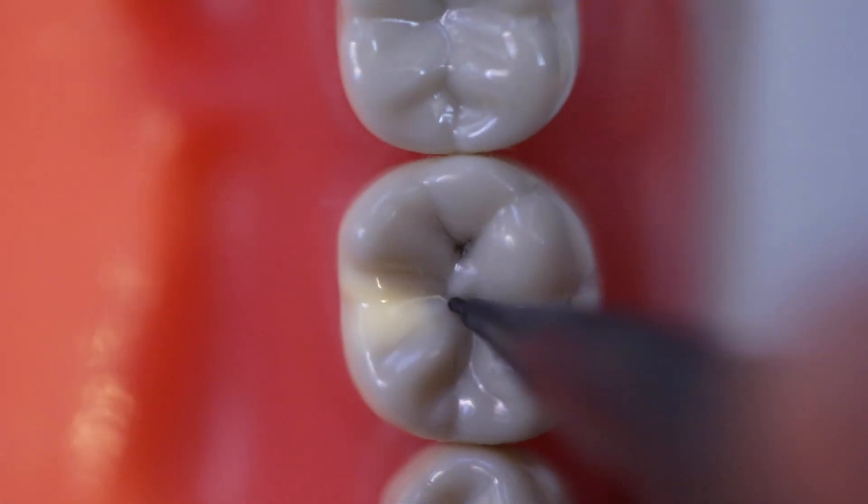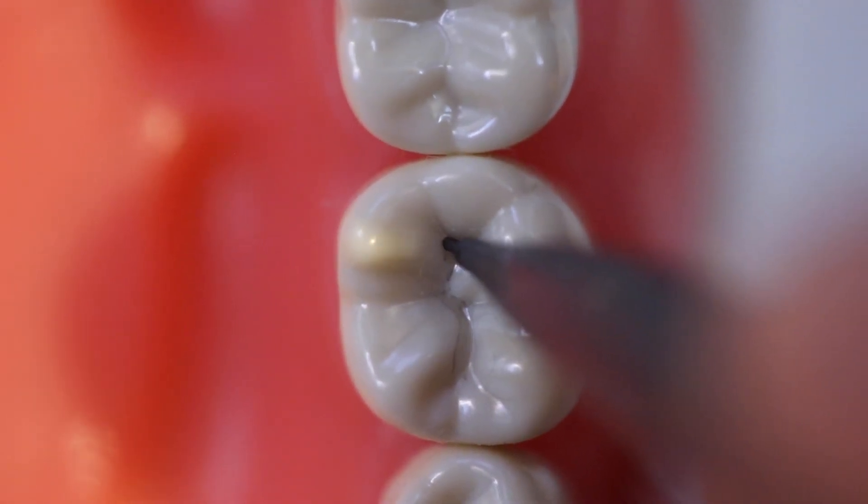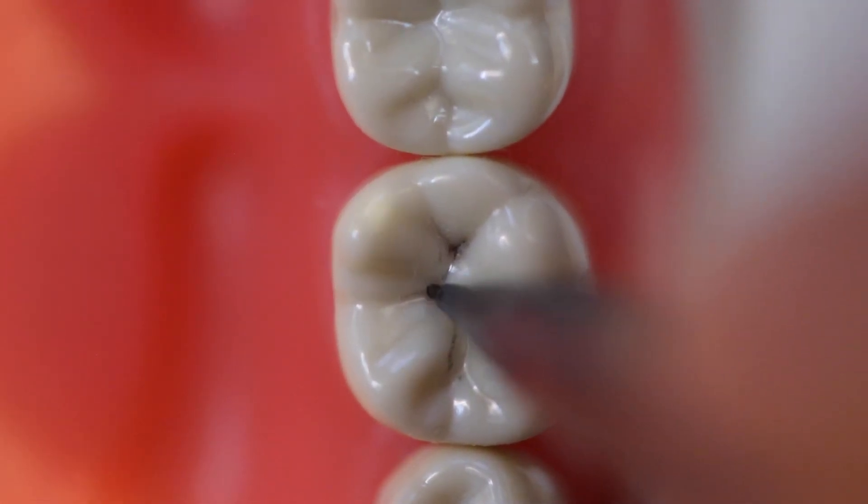Let's take a look at this live. In this demonstration, I'm keeping in mind that the primary grooves are going to be followed and not the secondary grooves. It's really important for you to distinguish those from each other.